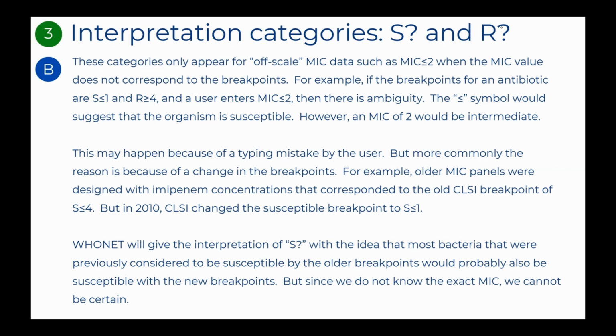The ≤ symbol would suggest that the organism is susceptible. However, an MIC equal to 2 would be intermediate. This discordance between an MIC value and the breakpoints may happen because of a typing mistake by the user, but more commonly, the reason is because of a change in the breakpoints.